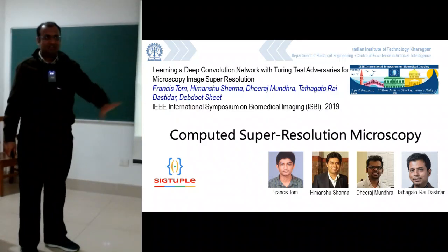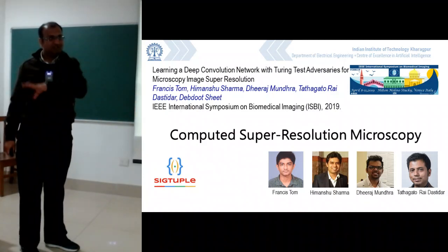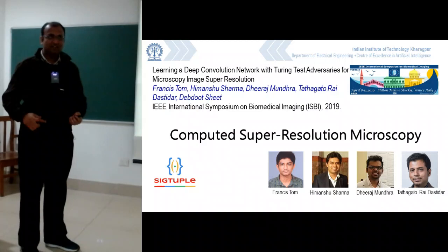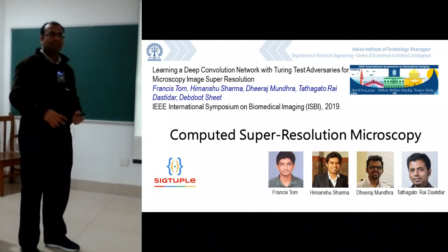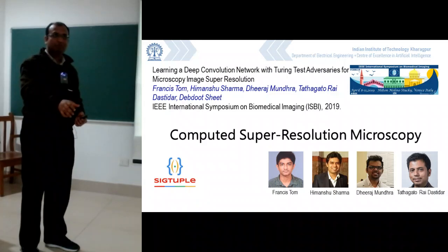So their AI engine and everything takes about roughly 5 to 6 minutes in order to read and analyze a whole slide image and give a report, and we are able to acquire images in the same order in which an AI inference engine runs. And that would pretty much make it a seamless process. So you put a slide, the slide is digitized, while the next slide is getting digitized, you have the AI run the whole report and you have a printout of it given.